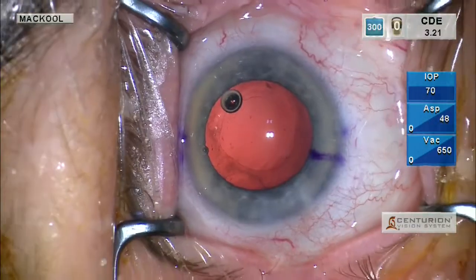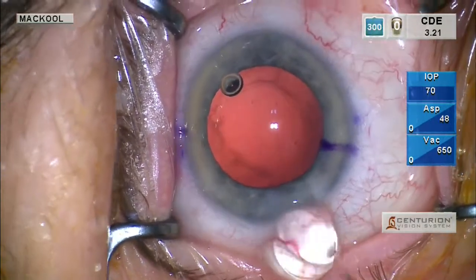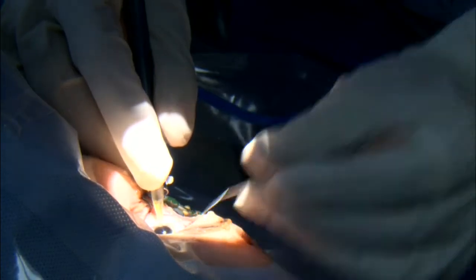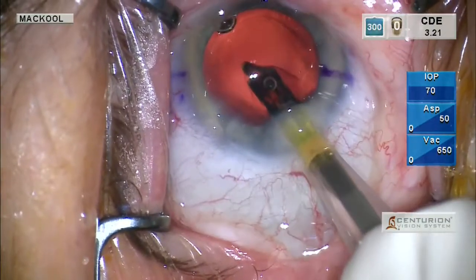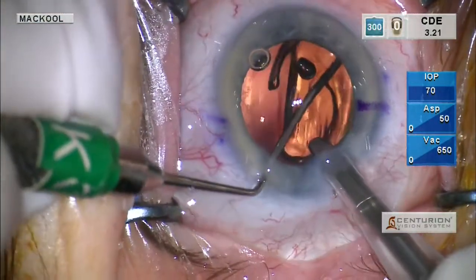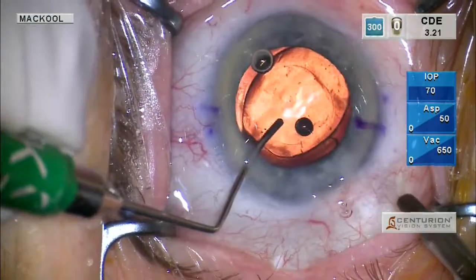And now we're going to put in our toric IOL. And our marked axis is 70 degrees. Now that's a long way to rotate this lens. Easy to rotate it a long way before it completely opens. So I'll get it almost to the 70-degree location.